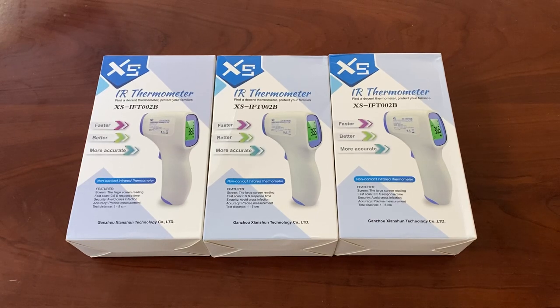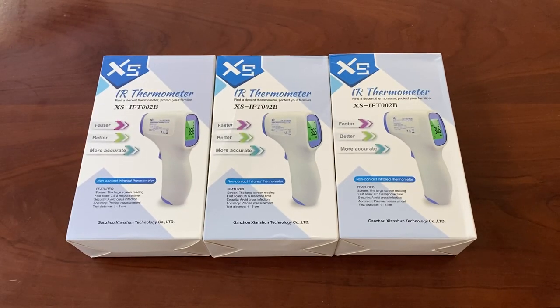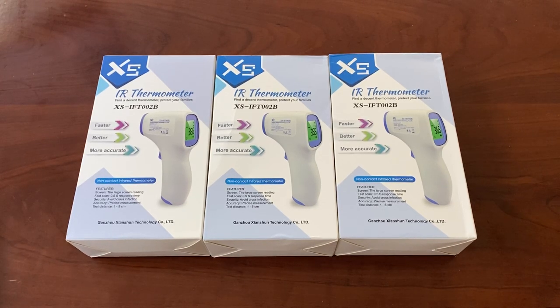Hey everyone, I hope everyone out there is doing well. It's a little crazy out there right now, especially here in America. Today we're unboxing the XSIR thermometer. IR stands for infrared. It's basically for your temperature.